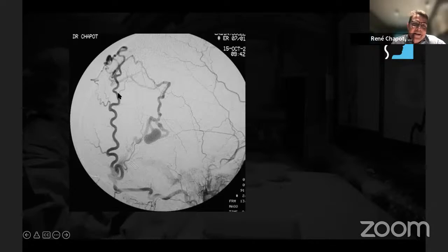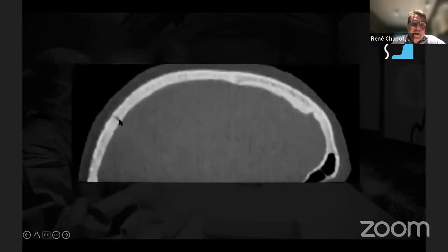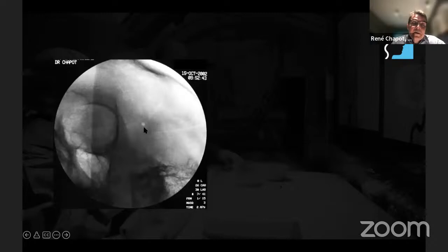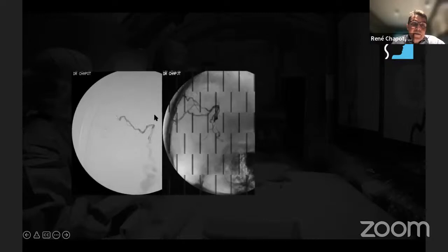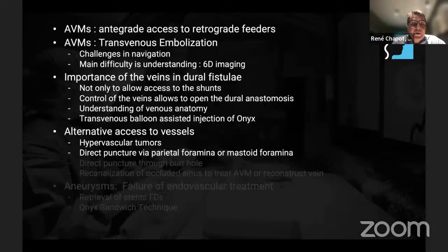And definitely you cannot navigate here. So if you want to go endovascularly, if you check what is this here, this is a parietal foramina, that you can see on different imaging. On the skull base, it's a hole that is very often more or less present or seen. And if you see it, then you can place a needle. Here is a tabula interna and externa. So when you puncture with a needle, of course, not to go too far away. And once I punctured with the needle, I placed a microcatheter inside, and this enabled to cure the fistula. So using the different foramen is a potential way to get access.